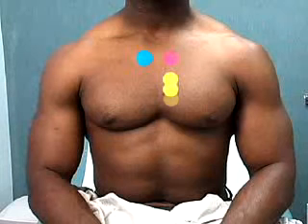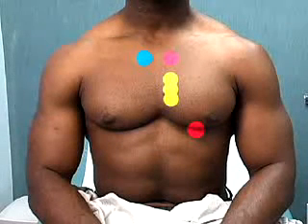Next, you will auscultate the heart with the diaphragm of your stethoscope. Listen to the aortic area in the right second intercostal space, the pulmonic area in the left second intercostal space, the tricuspid listening areas over the third, fourth, and fifth intercostal spaces at the left sternal border, and the mitral area in the left fifth intercostal space at the midclavicular line.